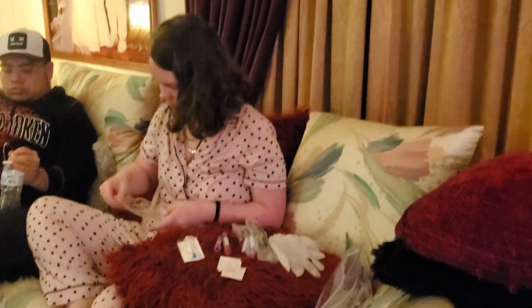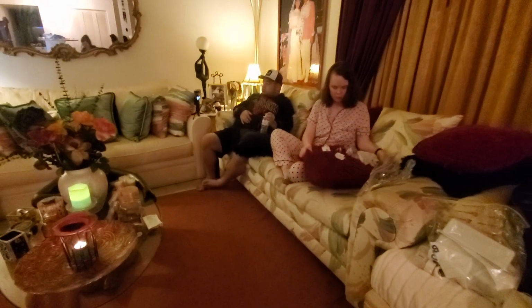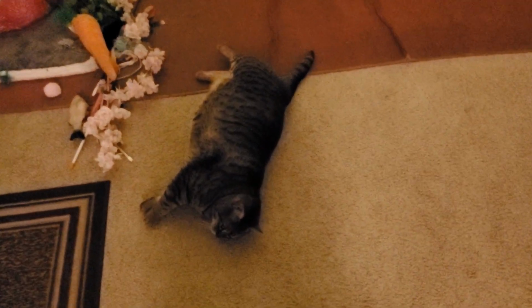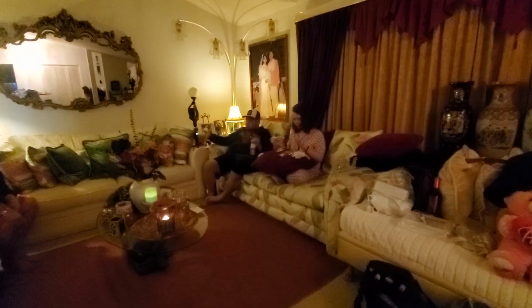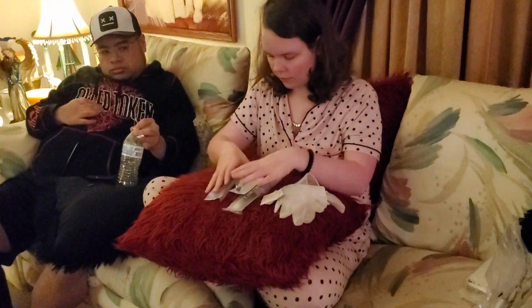I need my access device or vacutainer and alcohol wipes. I'm going to put this in the order that I'm going to use them. And then I'm going to flush, aspirate, waste, draw my blood, flush, wait no, access device.